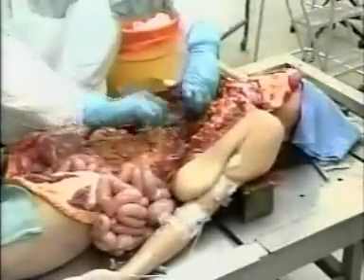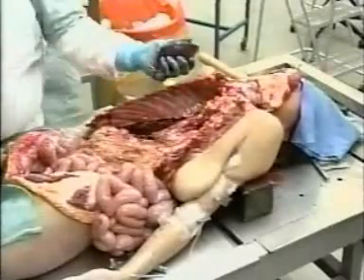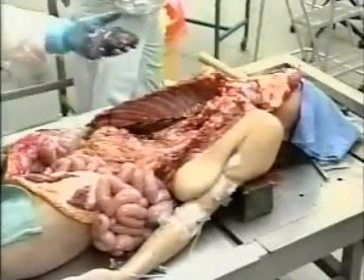Pardon me, spleen is coming out now. That sits in the left upper quadrant of the abdomen. That's about a normal shape and size.